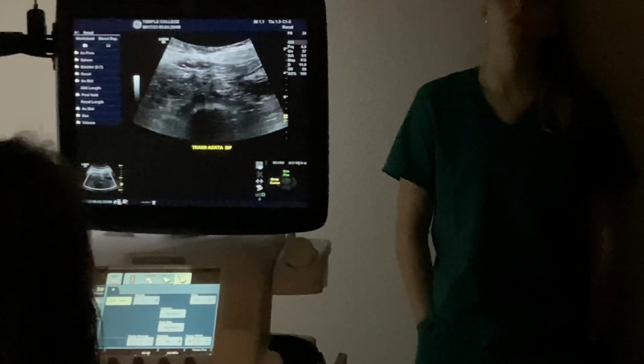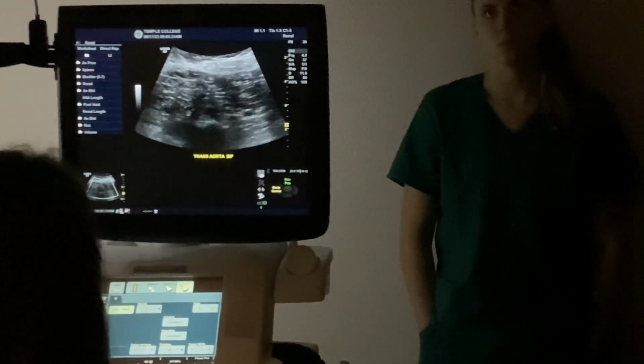And then, talk about turning on it. You guys already did turning on LAX. Yeah, we're working on it.